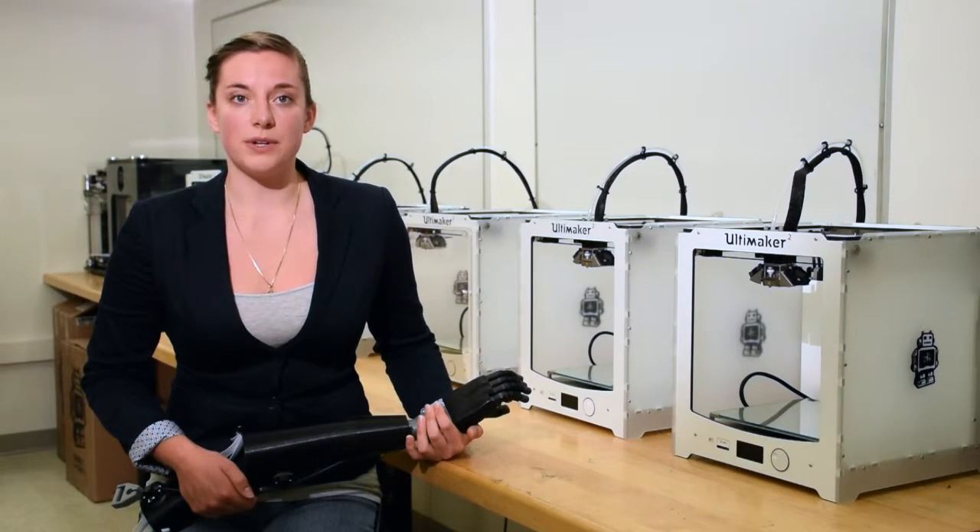Traditional prosthetics can cost upwards of $3,000 in materials alone. Our entire system can be made for less than $100.